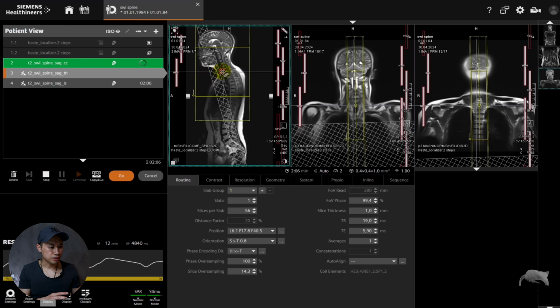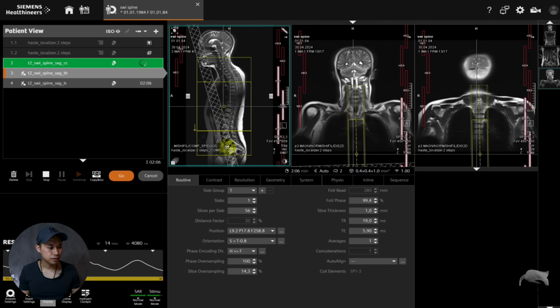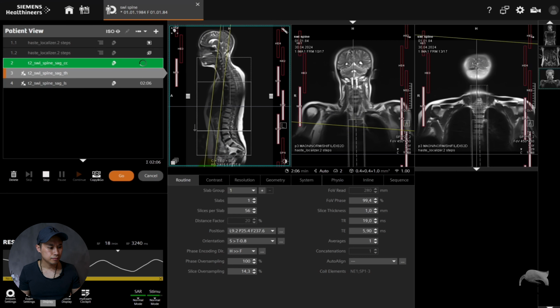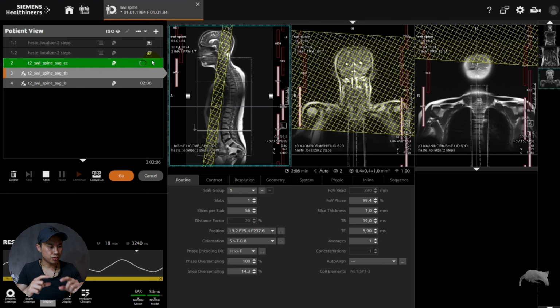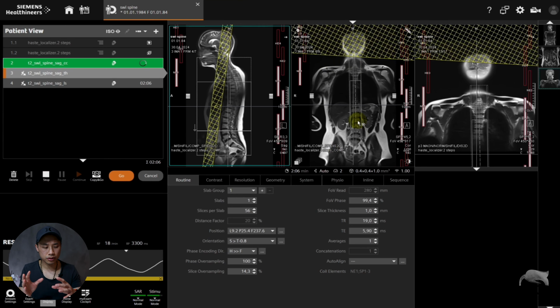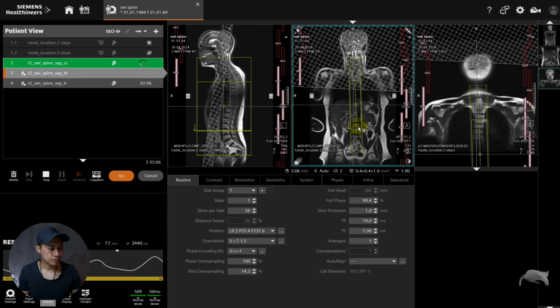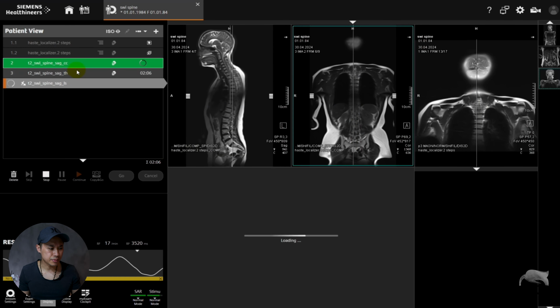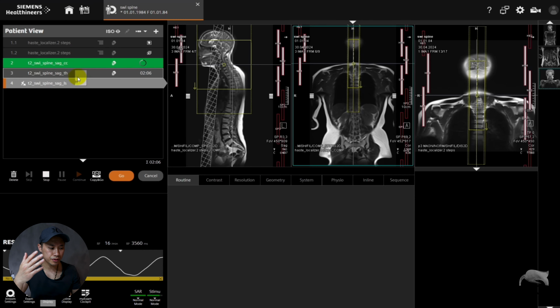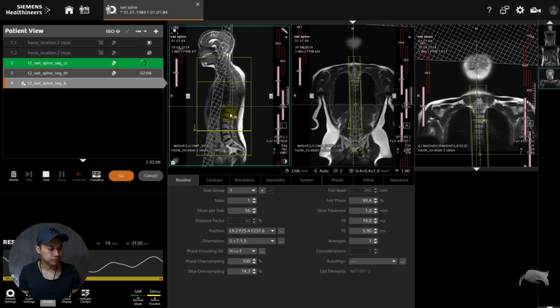And then I can just do Control 7, and there will be a very good overlap. Like that, Control 7 on the keyboard. And then I will know there will be a perfect overlap. So remember to position in the two planes, sagittal and coronal. For lumbar, the same here: I copy the thoracal part, the previous part, and then I use Control 7.